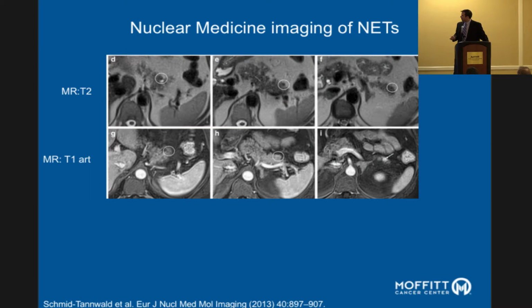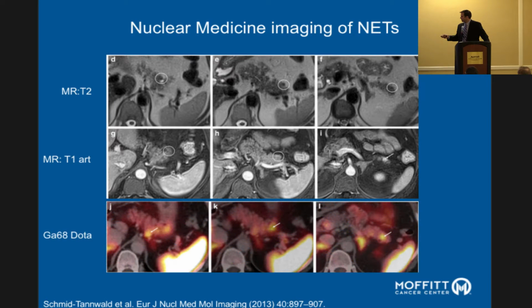This is with MRI, which, depending on the indication, but in most indications, is going to be far more sensitive than CT. So even with state-of-the-art CT, state-of-the-art MRI should be even better. This person was another suspected pancreatic neuroendocrine tumor. These areas where the tumor actually is are circled, and we see no abnormality that sticks out from the pancreas on these images. Yet when you do the gallium PET CT, you can see quite clearly three pancreatic tumors that our most advanced medical imaging could not pick up.